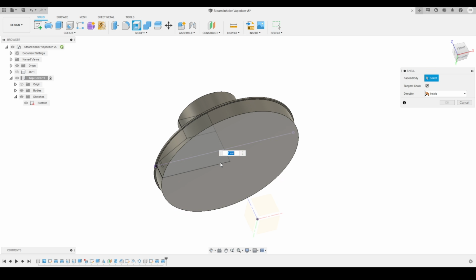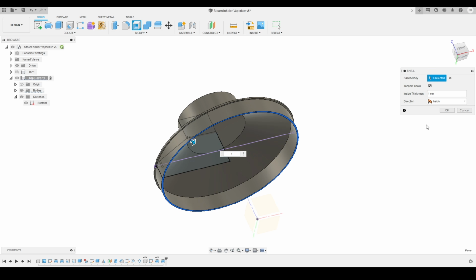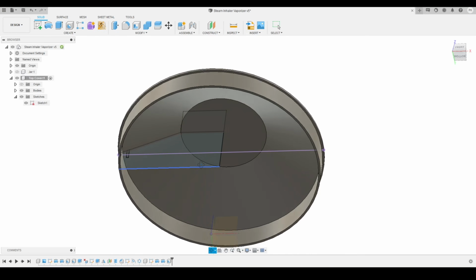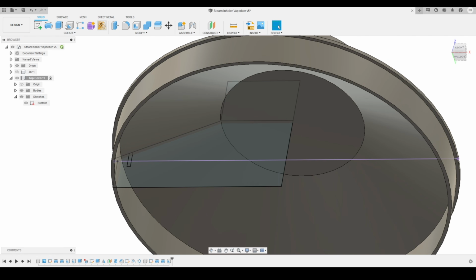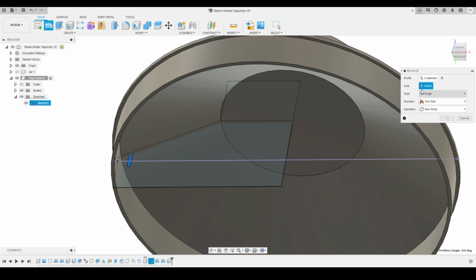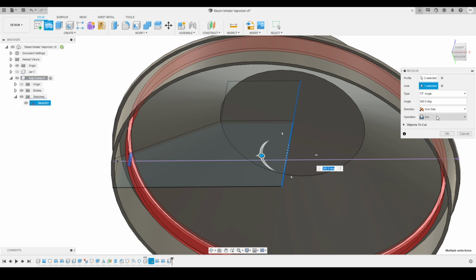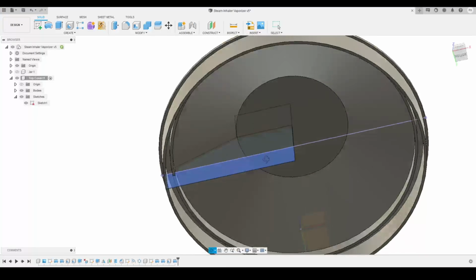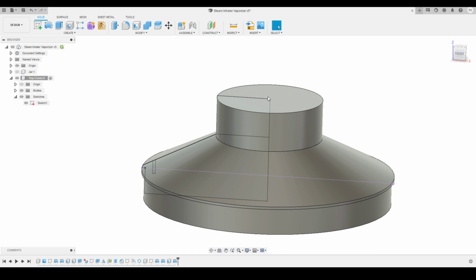Now we'll activate the shell tool. I will shell this particular part by this much thickness. Here you can see this is the result we are getting, and we'll repeat the same shell tool. Before that, I just want to revolve this particular part, and I will make sure that this one has a join, and we'll press OK. Here you can see this is the shape we got after revolving all the three profiles. And I will apply the shell tool on the top body as well.